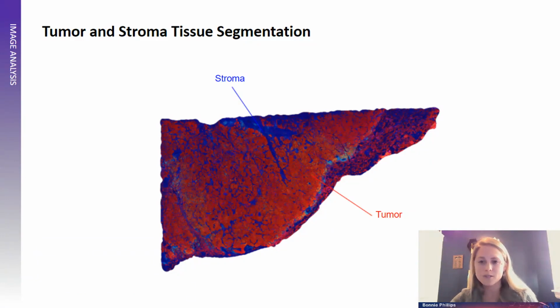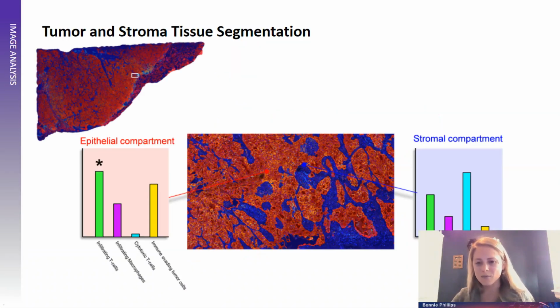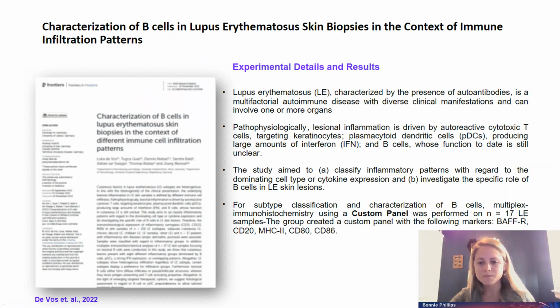the tumor versus the stroma utilizing a mask like with cytokeratin, where we can easily differentiate tumor from non-tumor areas, and we can compare the cell number, cell frequency, or density within these two regions. And of course, this can give us a large amount of information to compare what's in the tumor versus what's present in the stroma.